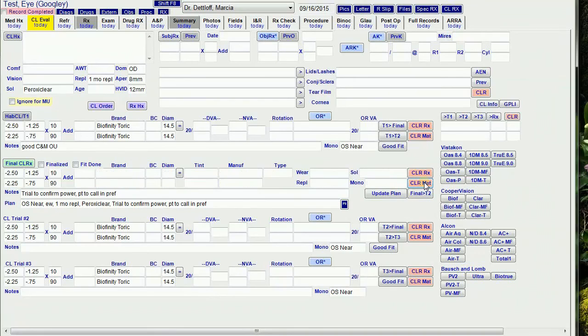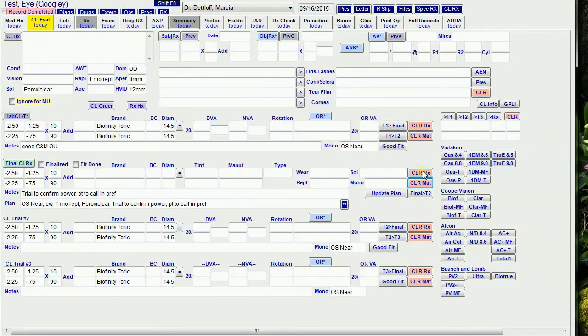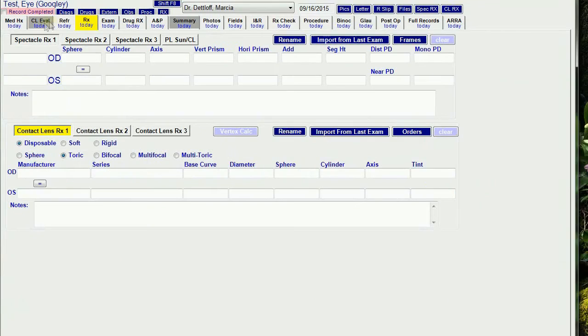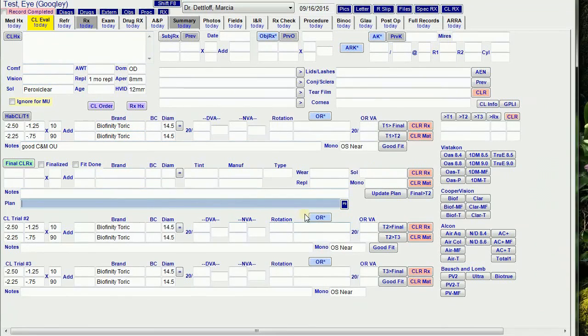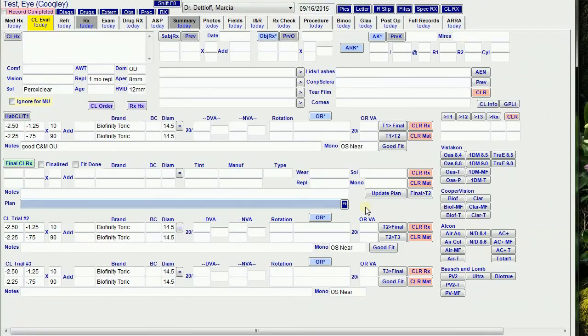The clear material button clears everything from the brand to the right, and the clear RX button clears everything. I also clear the Contact Lens RX from the RX tab and uncheck the finalize and Fit Done buttons since the change to the finalized RX would mean that the info in the RX tab would be wrong.